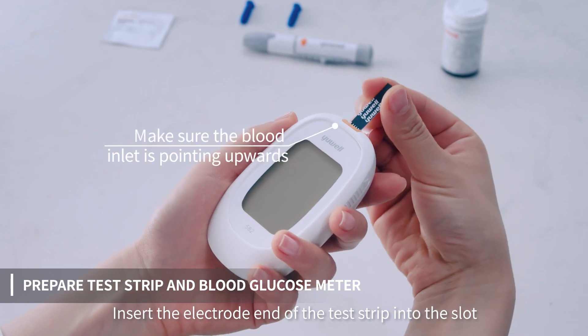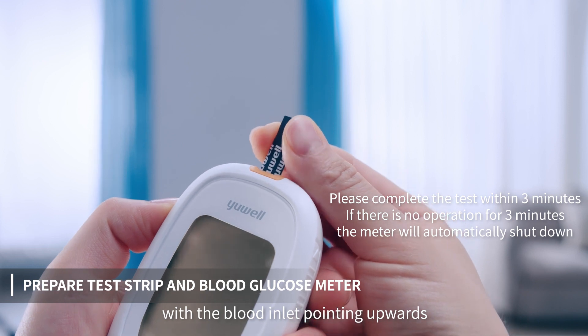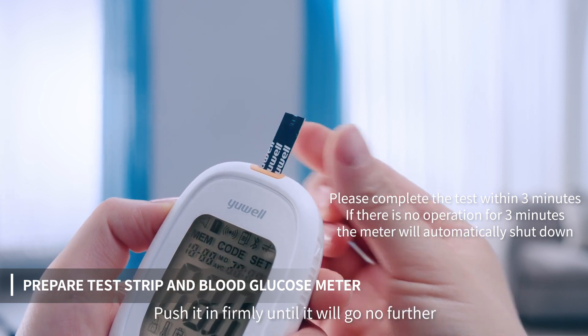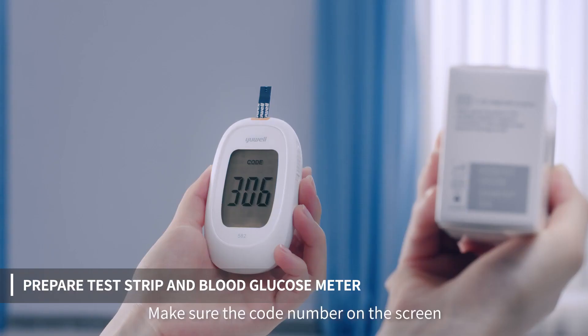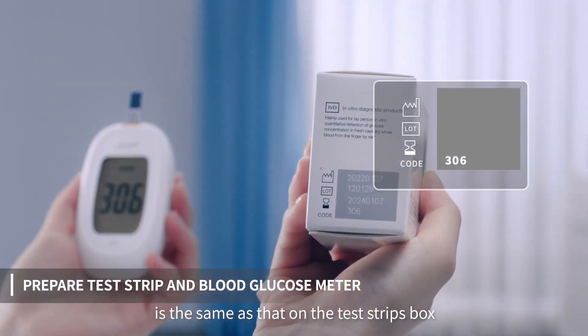Insert the electrode end of the test strip into the slot, with the blood inlet pointing upwards. Push it in firmly until it will go no further. Make sure the code number on the screen is the same as that on the test strips box.